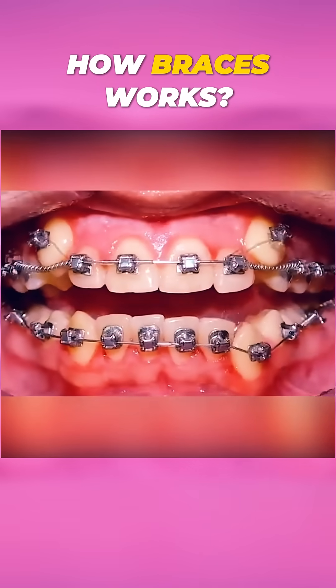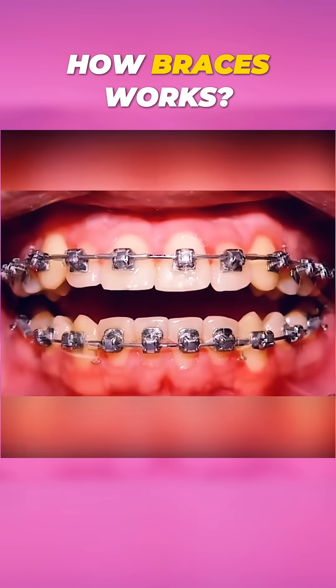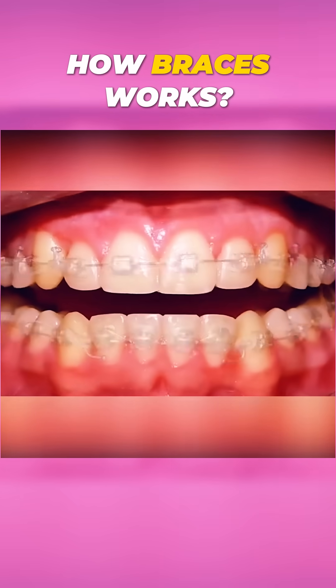Ever wondered how braces straighten your teeth? Braces fix misaligned teeth using brackets, wires, and bands.